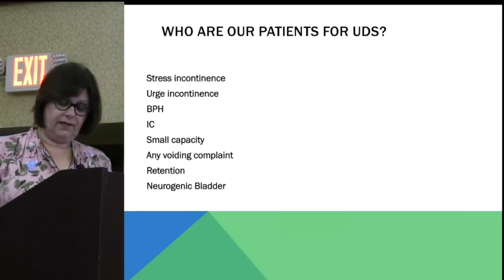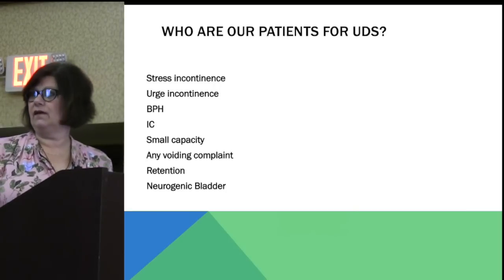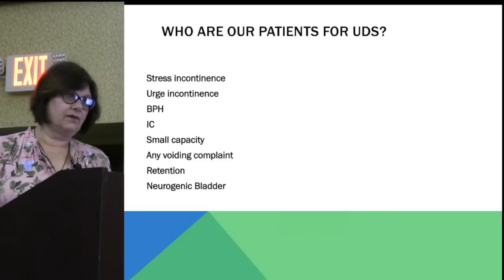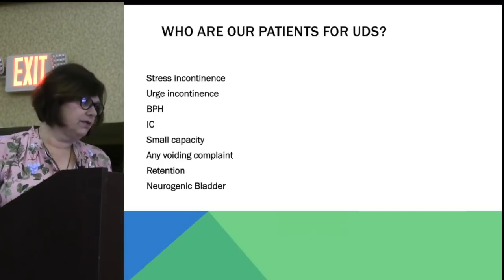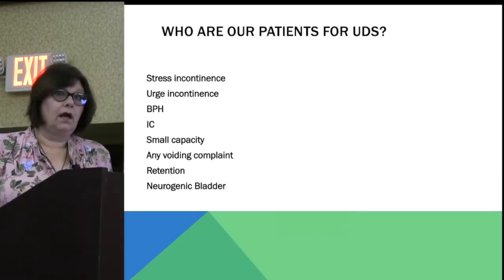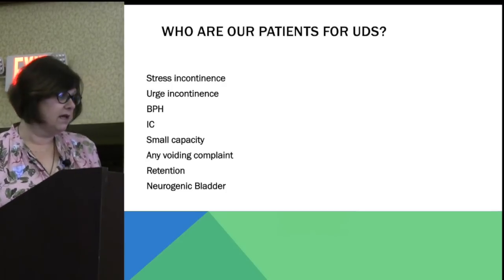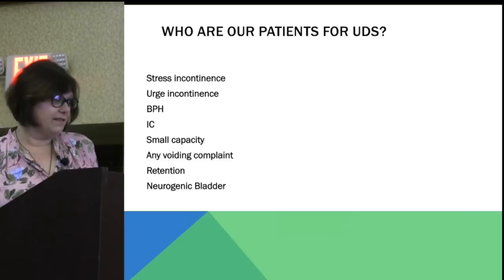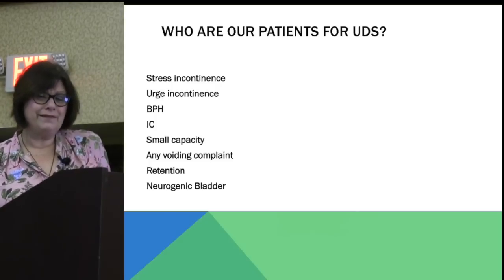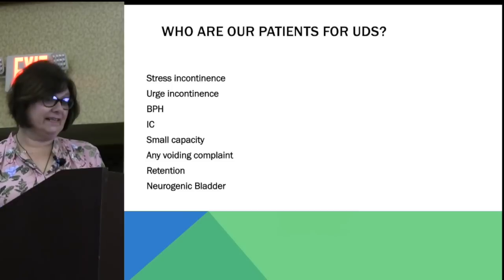Those people complain of retention, you know, it takes me forever to go. You do a bladder scan and find that you've got 200-300 mLs of urine left or more on someone after they've just gone to the restroom. And then a neurogenic bladder, people say, oh, I go 8 hours and I don't really need to go. And you scan them and they've got like 1,000 mLs in their bladder. We're looking for a lot of things with urodynamics. And one of the main things is we also want to protect the health of the patient. We want to protect the health of their kidneys.